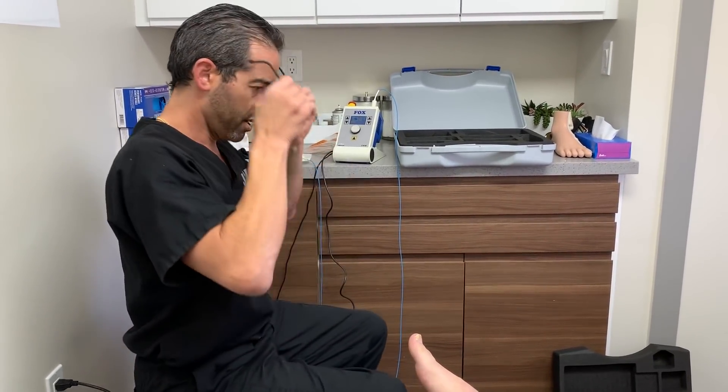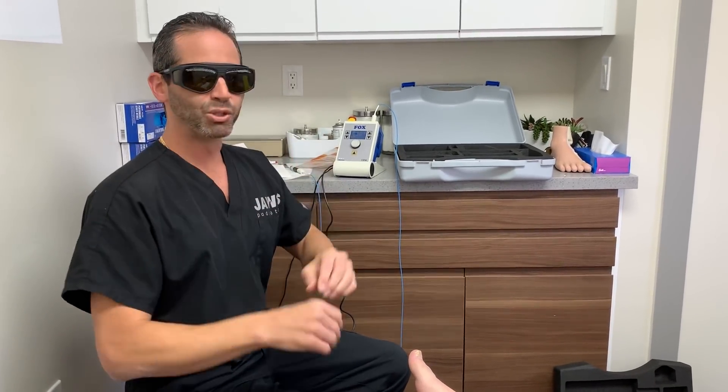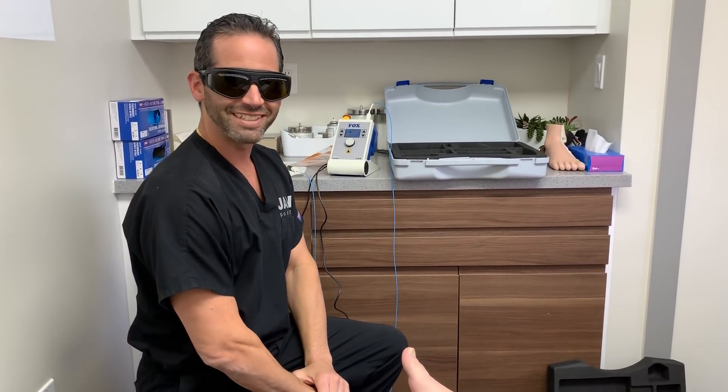I have to put on my blue blockers — you got to love them.